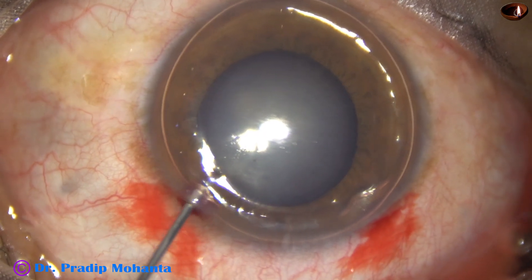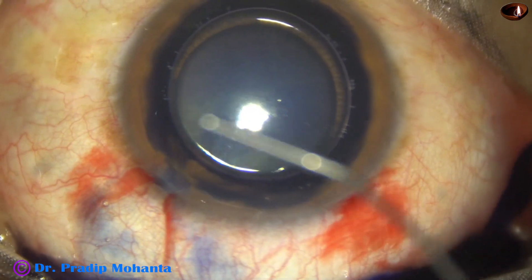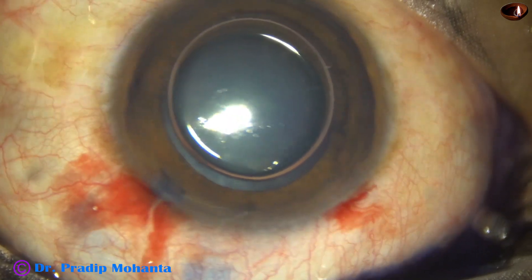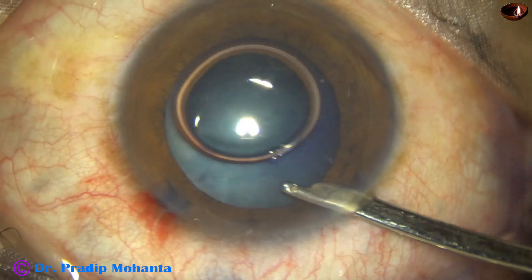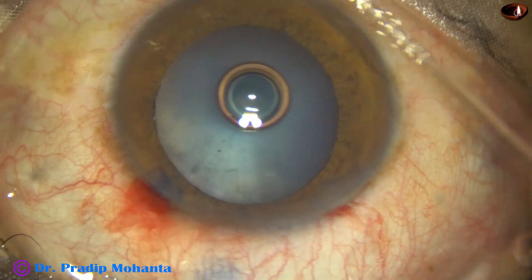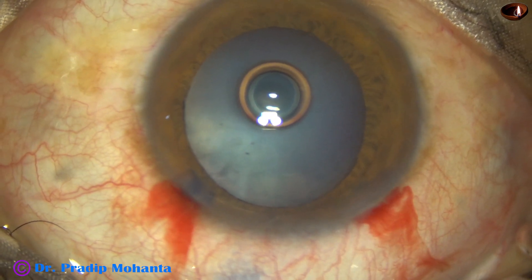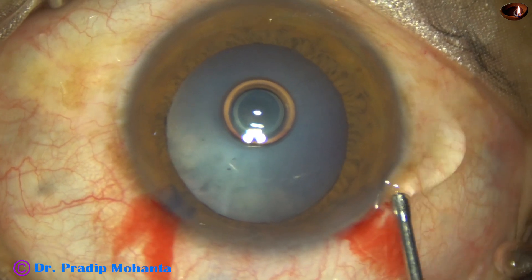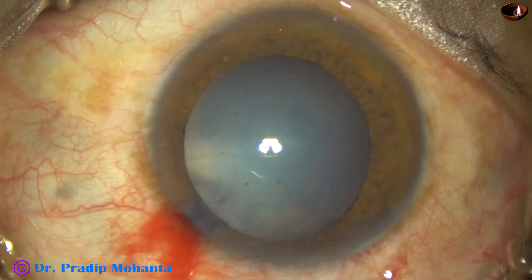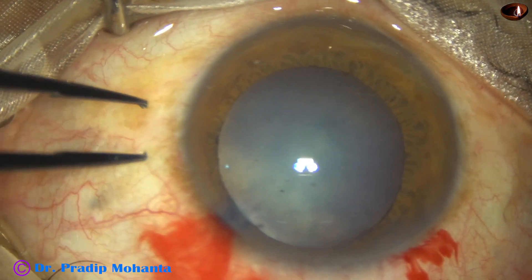In this case, the main problem is the rhexis, because the silicon oil is already putting an upthrust on the lens. The lens is almost mature — the cataract is almost mature — and there is some convexity of the lens. The patient is also young, 32 years old, so rhexis runout may occur in such cases.